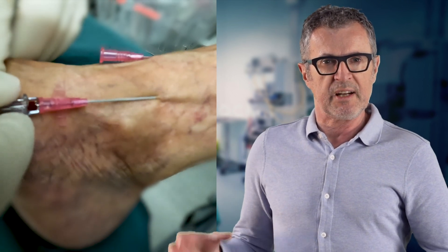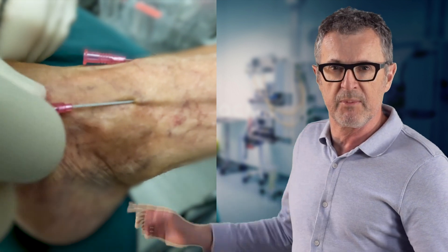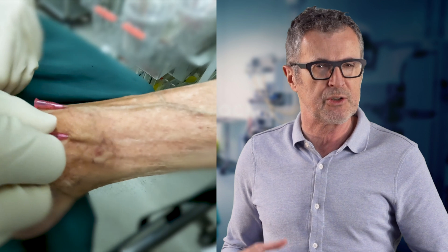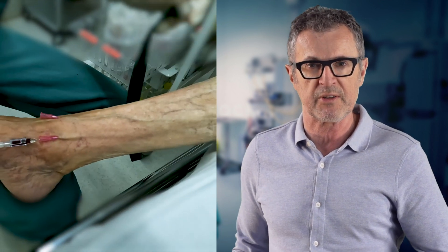Note how we selected a longer IV catheter — in this case 4.8 centimeters with flat wings — which makes it easier to secure the catheter to the skin and more comfortable for the patient.